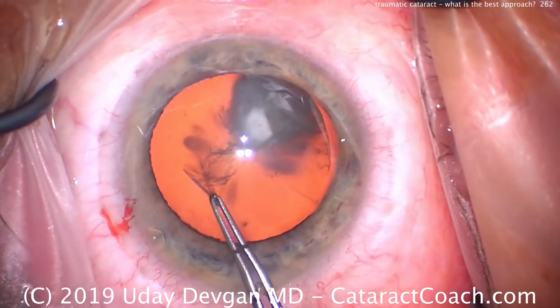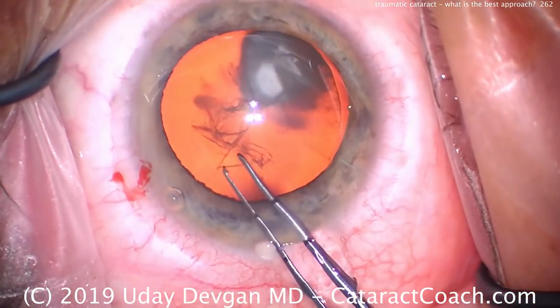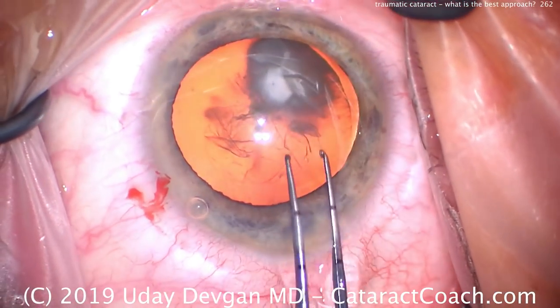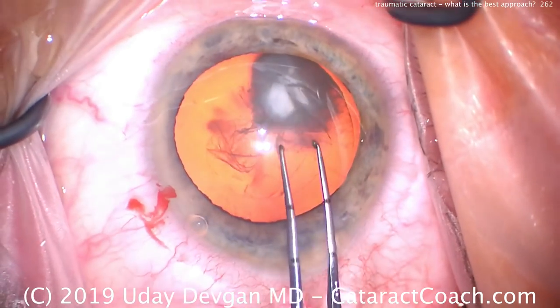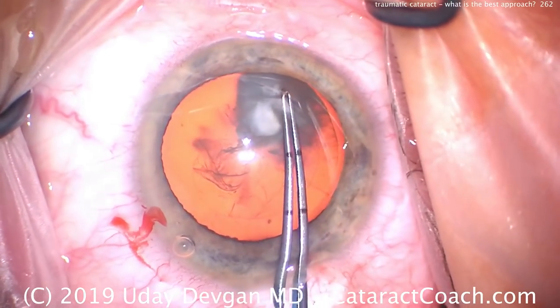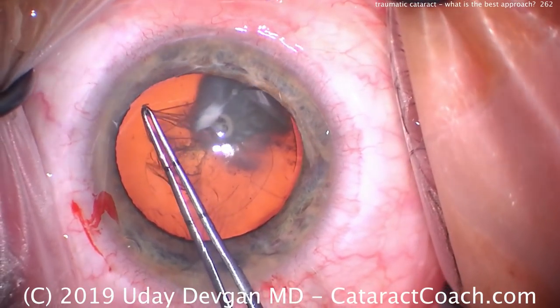Let's go over this part where we can actually see it, where the capsule is normal. Now notice there's no wrinkling in the capsule, so it looks like there's pretty good support. Now when I come to this area, I want to encompass that white fibrous plaque. And also, don't let go of the capsule in the area where you can't see it. So keep going.